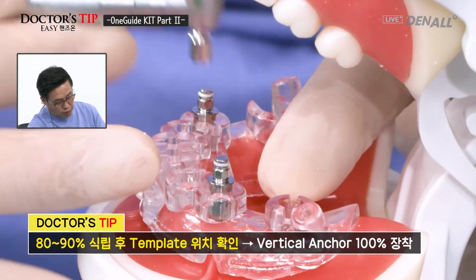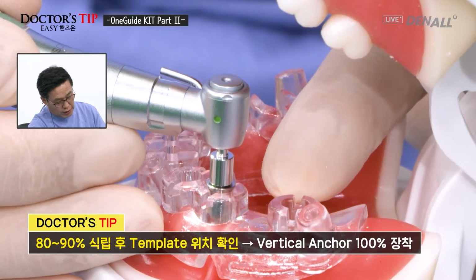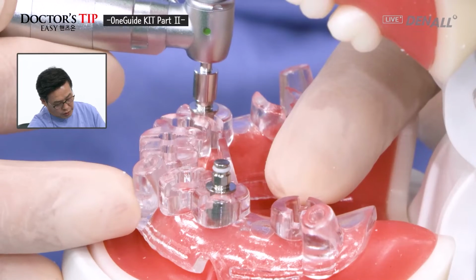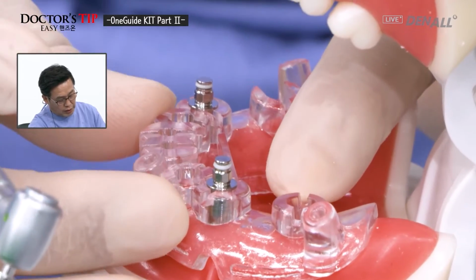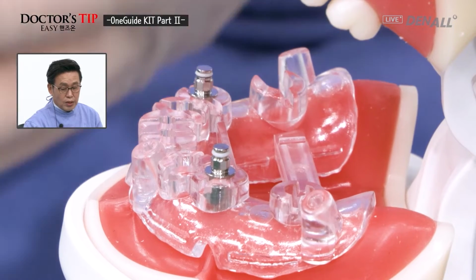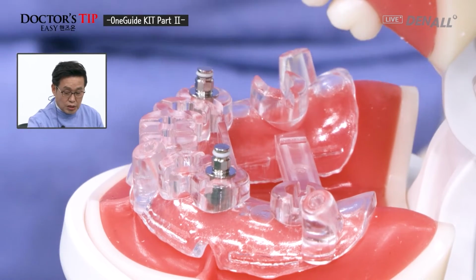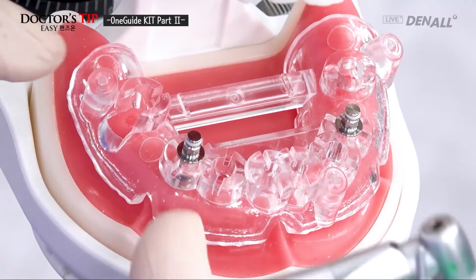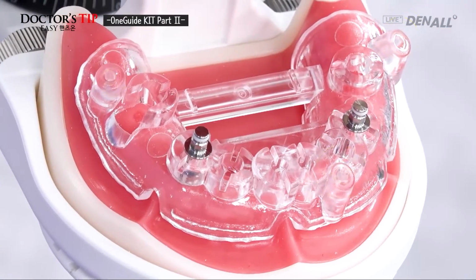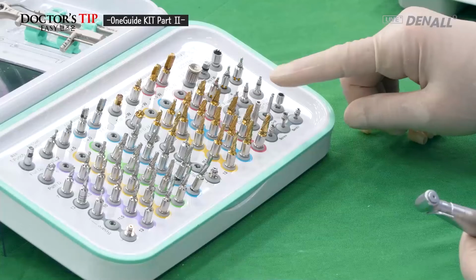Do it in turn so that it is fully mounted, so that there's no movement. Vertical anchor is mounted fully on both sides. After that, because it's a fully edentulous case, as supplementary measure, lateral anchor is going to be used. 3 anchor holes have been prepared.